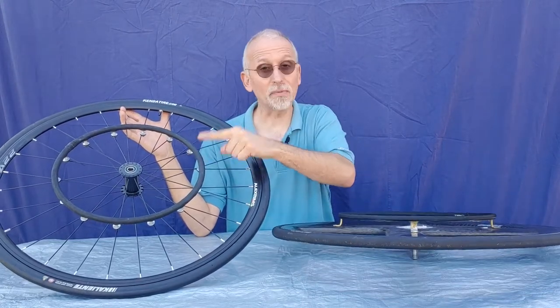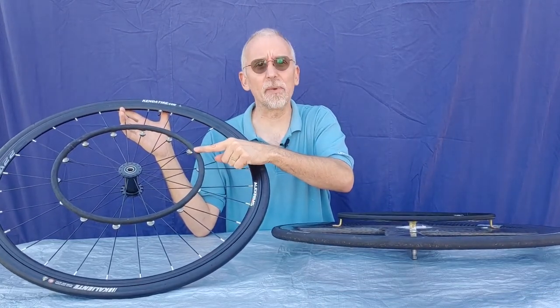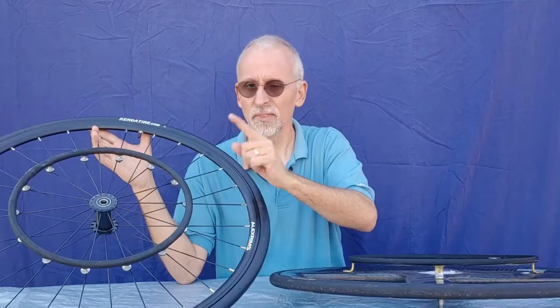Racing wheelchair hand rims — sometimes you have to take them off and then get them back on. How do you do that? Let us help you with that.